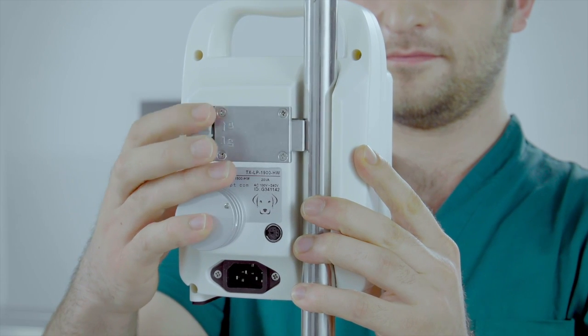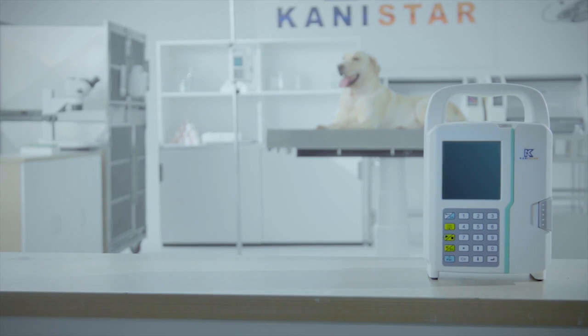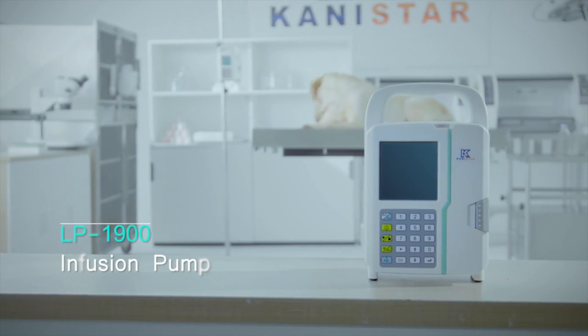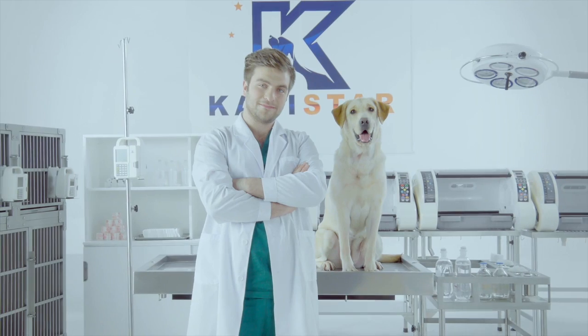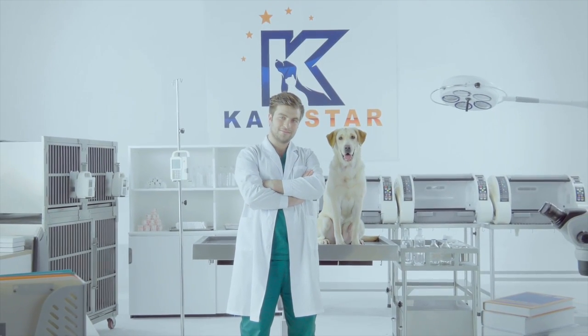Easily mounted to cages, doors, or infusion bars. Canistar TransVision LP1900 Infusion Pump — a truly pet-oriented infusion pump. Presented by Canistar Group.